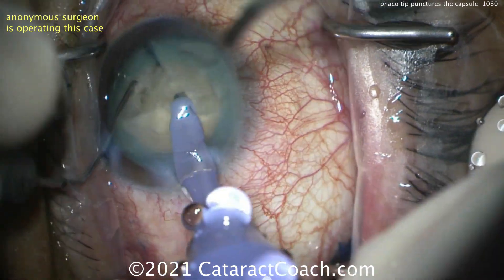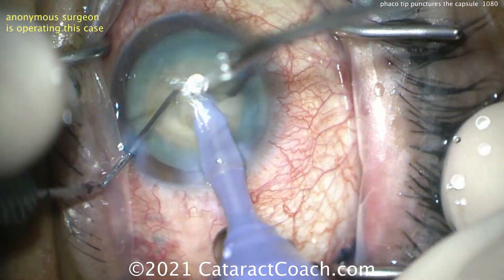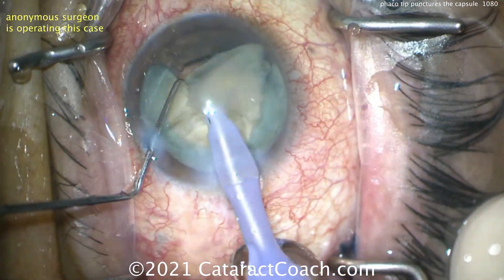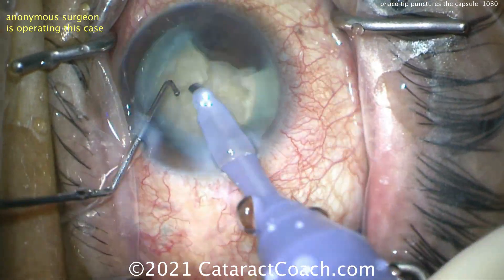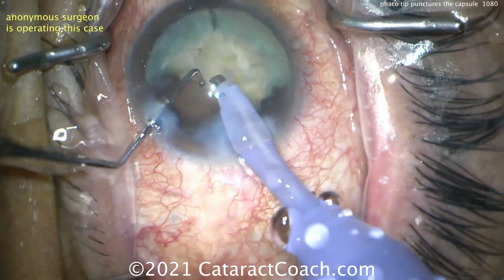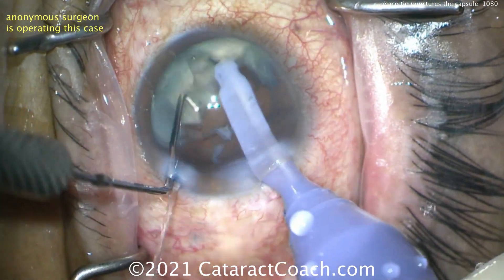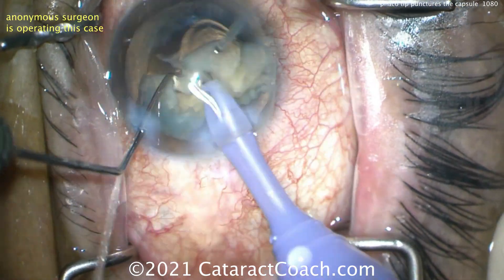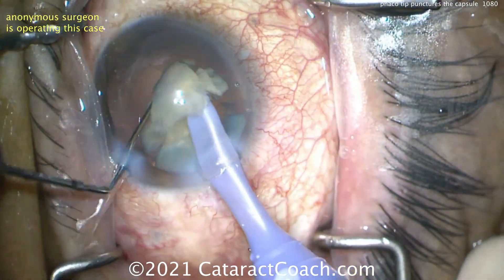Some of it is kind of fibrous and it's hard to remove pieces without doing extra sub-chops, so rotating it, really trying to separate the pieces. Good technique — pretty good. Removing that nuclear piece looks great, removing another nuclear piece, then chopping. Looks pretty good. But where's the issue? Watch carefully — we'll slow down the video in just a moment.